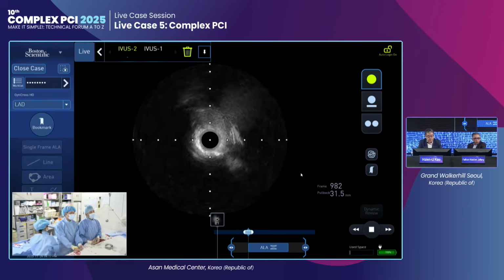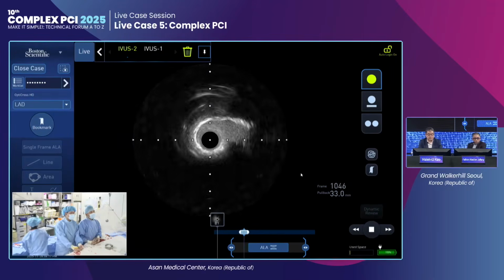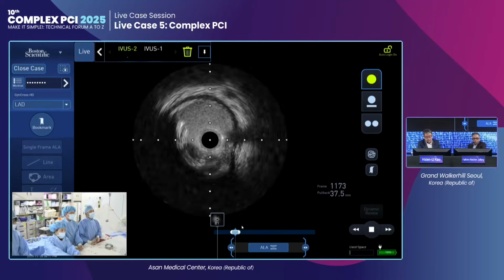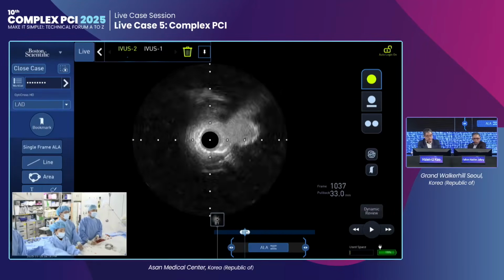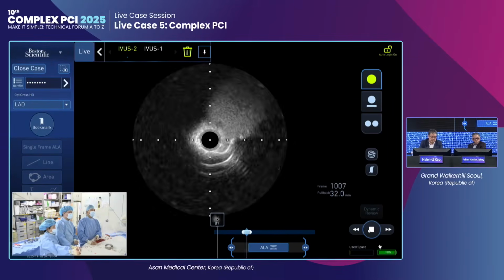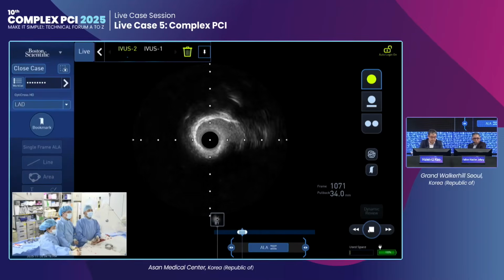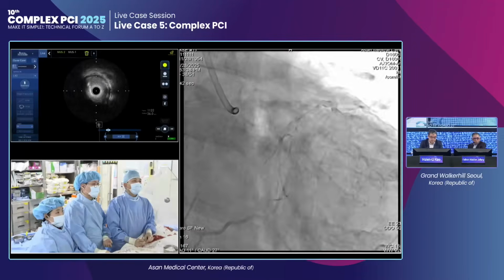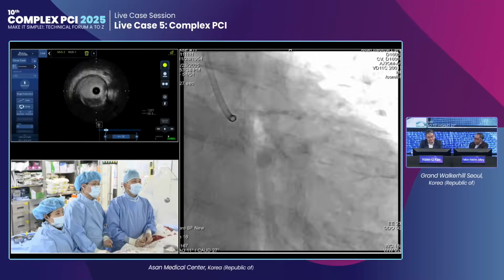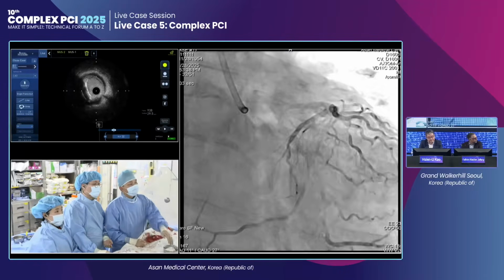Yeah, this is the ostium and left main. So you're seeing some rotablation effect with some reverberations, but obviously you need to modify the calcium more. What do you recommend for that? A larger size burr, or NC, or IVL? What would be the best option for this patient? What does the panel think?